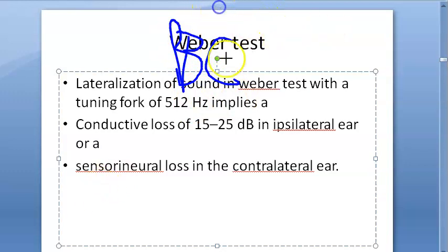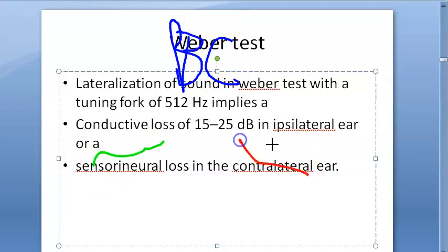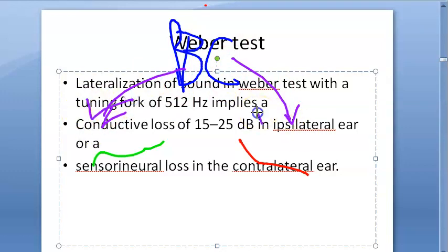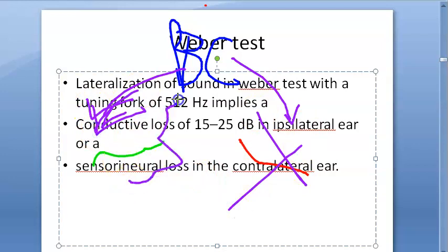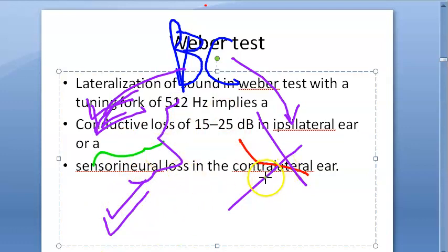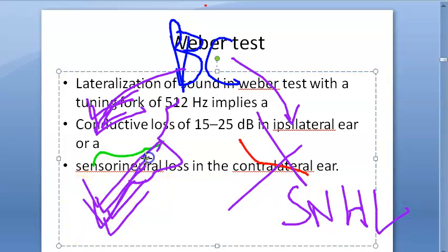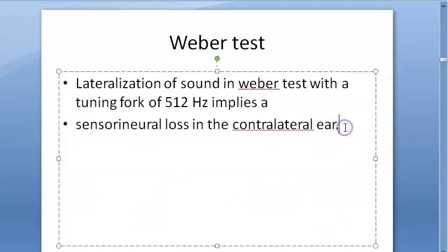Weber's test is a bone conduction test — you keep it on the bone and expect the bone to conduct. If one side has a perfectly fine nerve and the other has an impaired nerve, bone conduction happens to both sides, but the damaged side cannot conduct the signal to the brain. So the person hears via the normal side. In sensorineural loss, lateralization is to the contralateral ear. It can also indicate conductive loss in the ipsilateral ear.